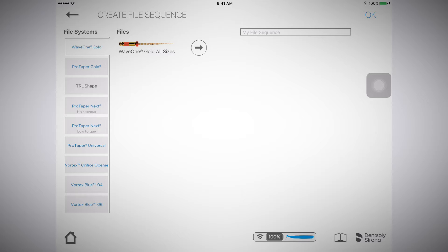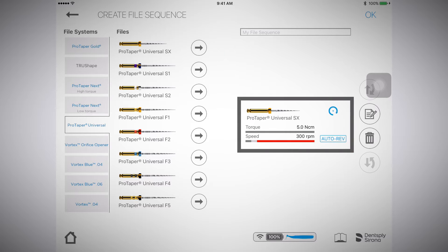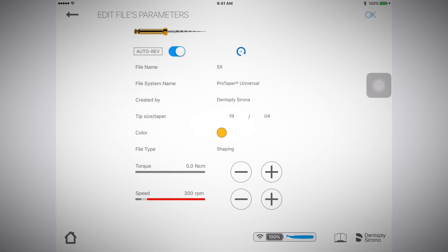For example, I am going to start off with the ProTaper Universal SX. I will select the arrow button next to the file to add it to my sequence.